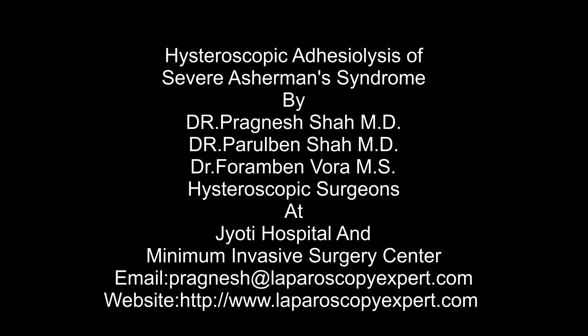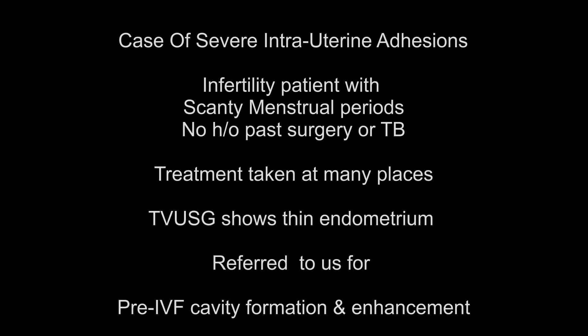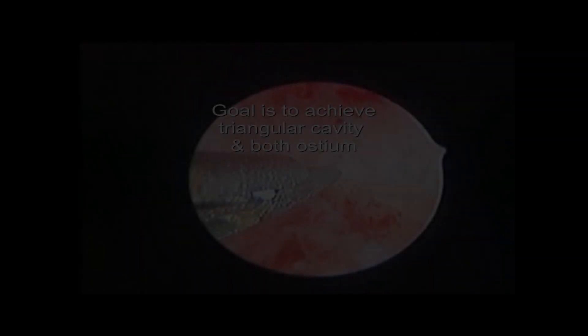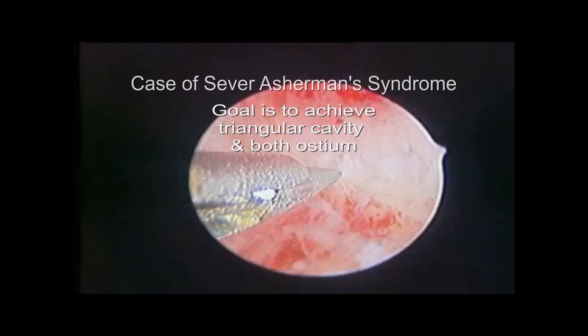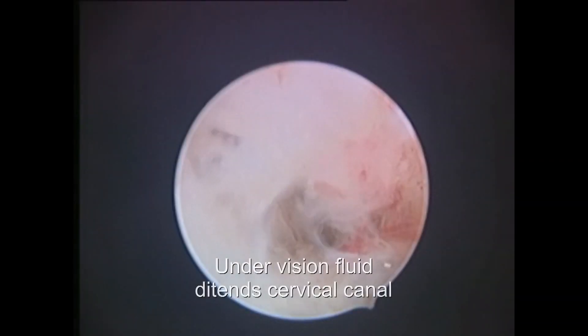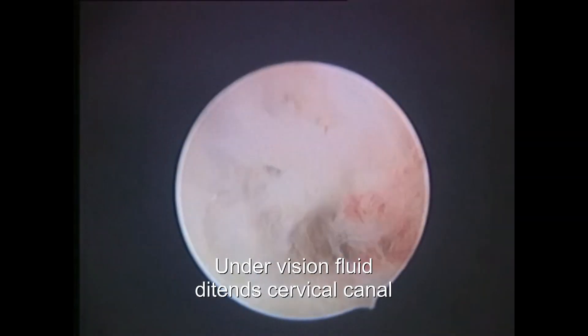This is a video of hysteroscopic rehabilitation for Asherman's syndrome. This is a case of an infertility patient with a scanty period and severe Asherman's syndrome, and let's see how we proceed and do this.